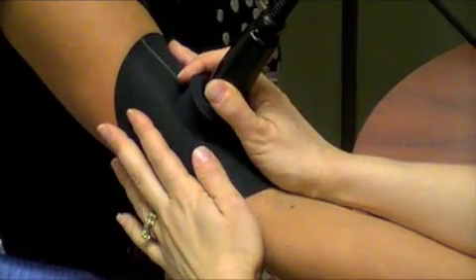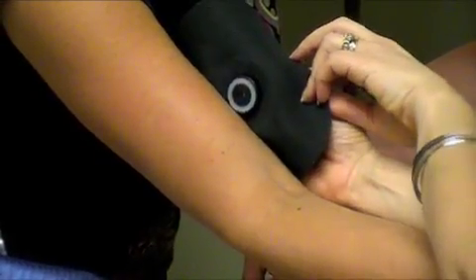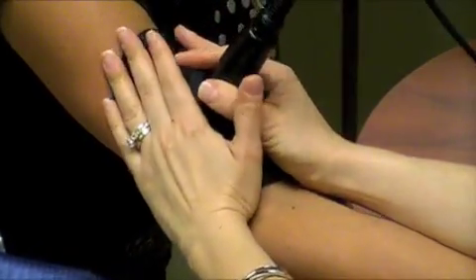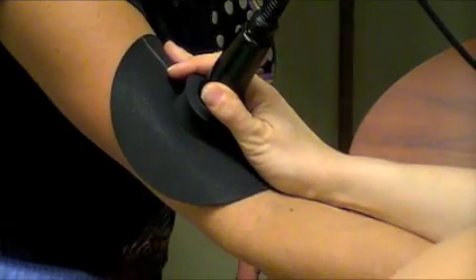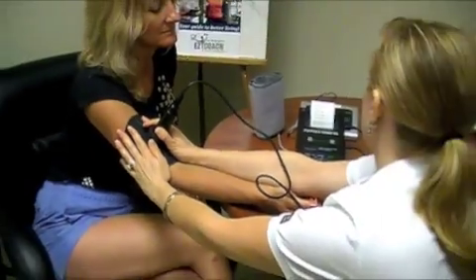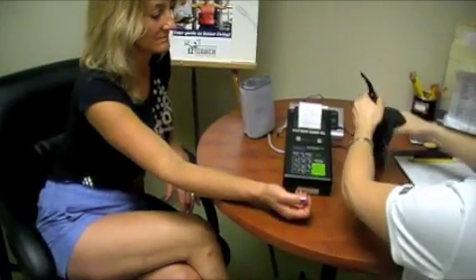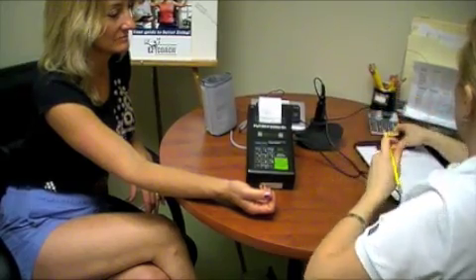After the Futrex indicates a 2, briefly remove the wand from the upper arm. Replace the wand in the exact same spot and press Enter again. Remove the wand. Record the body fat percentage in the field designated on the test sheet.